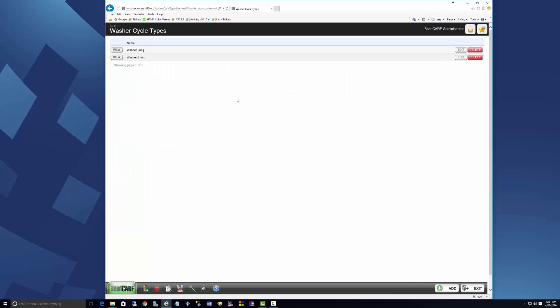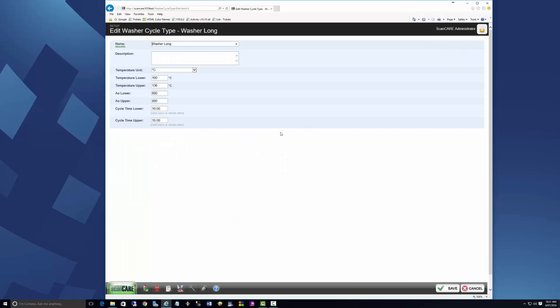For washer cycle type parameters, you can select Celsius or Fahrenheit as a unit of temperature.